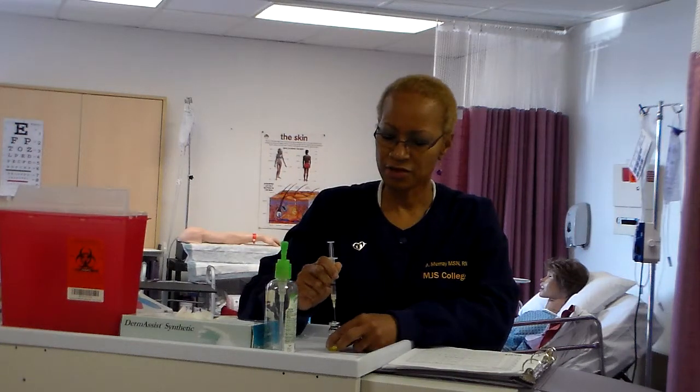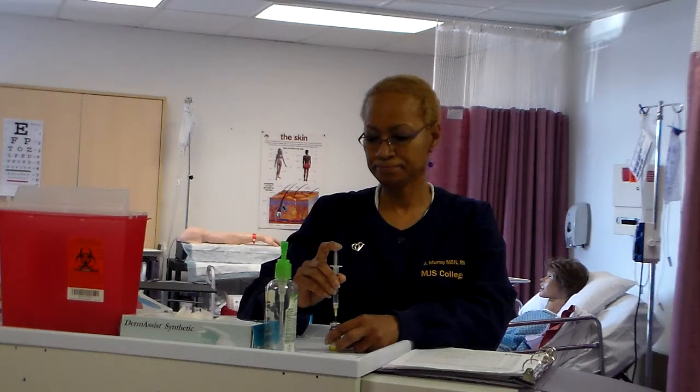Okay. With vial on flat surface, insert tip of needle with beveled tip, entering first through the center of rubber seal. Okay, so you want to make sure that the vial is down on the flat surface. You're not doing it up in your hand, but on a flat surface, and you're going to put it in the center of the rubber stopper, making sure that your needle does not go down into the medication. All right? Apply pressure to tip of needle during insertion.